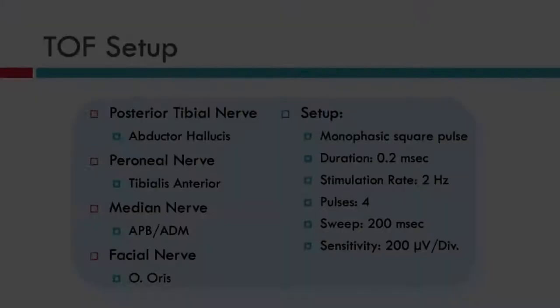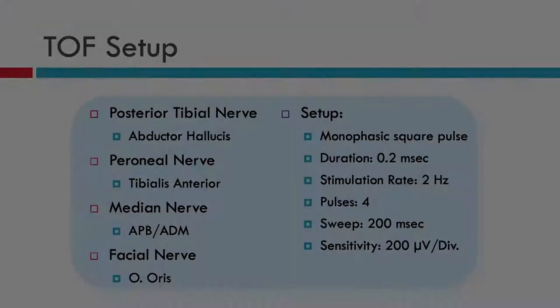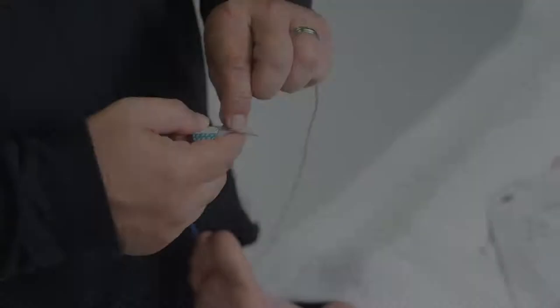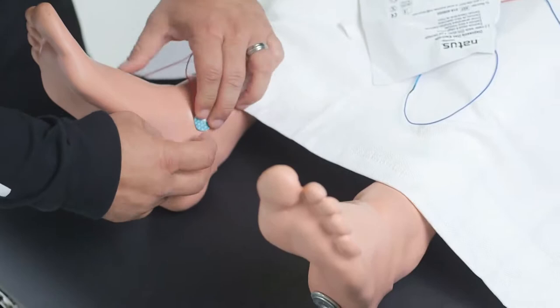For the setup, you need to stimulate the posterior tibial nerve in the lower extremity and record from the foot muscle. You can also stimulate the peroneal nerve at the knee and record from the tibialis anterior muscle, but let's focus on the posterior tibial at the ankle. Place the distal electrode (cathode) and the proximal electrode next to the medial malleolus, and do this bilaterally — if you have an issue on the left side, you can do it on the right side.